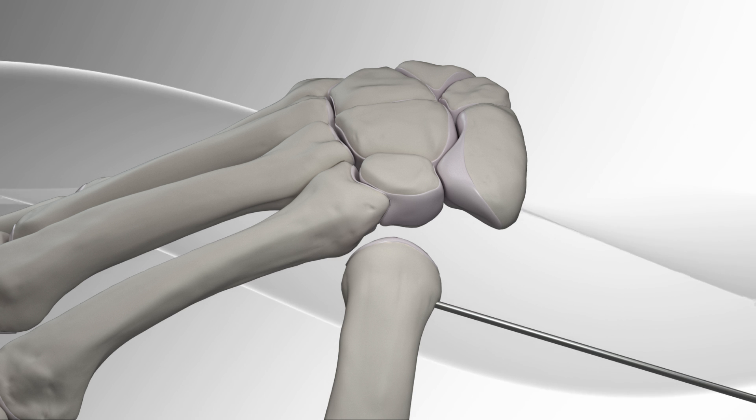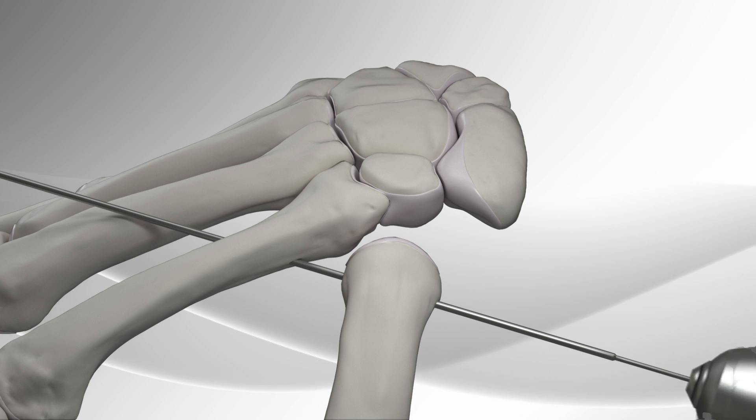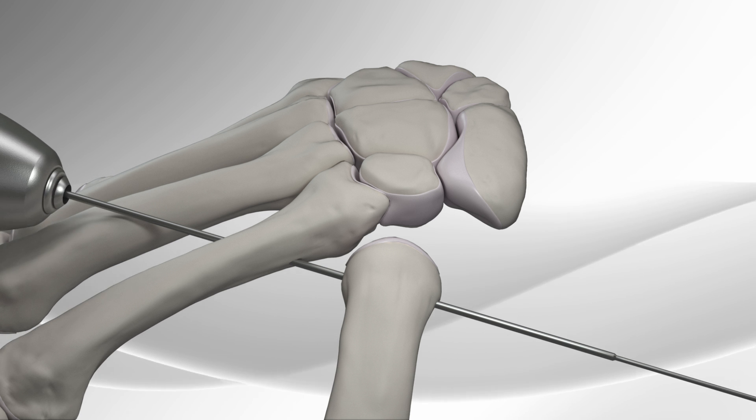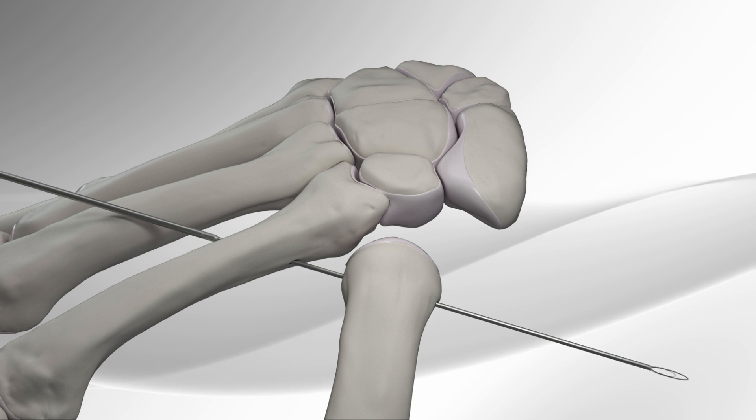A metal guide wire is driven under power from the thumb to the index finger. The guide wire has a metal loop in one end to allow the passage of the two strands of suture across both bones.